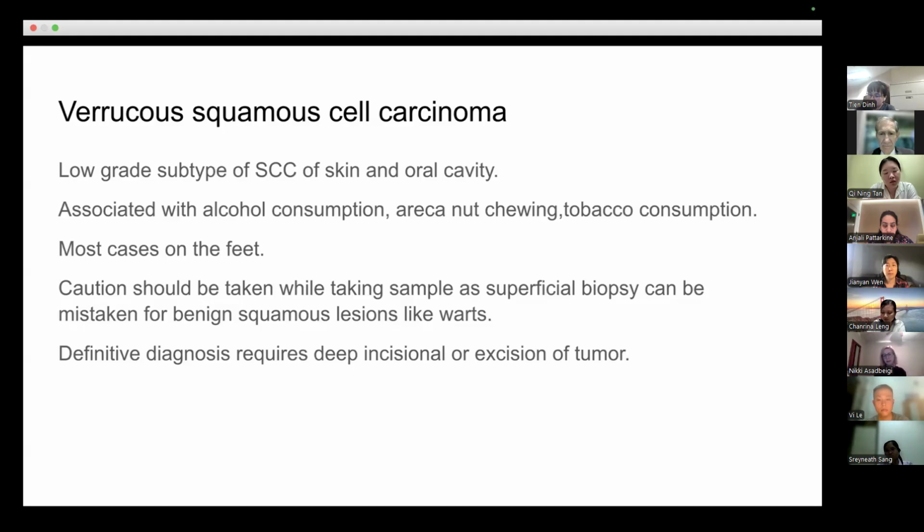They need to go back and take the whole thing out anyway, but they don't need to go after the lymph nodes. But there's no way to say it in a small biopsy, so don't overcommit yourself. That's something I learned. Sometimes it takes a phone call to ask what's going on and tell them what you're seeing, but there's no way to say it in the small biopsy.